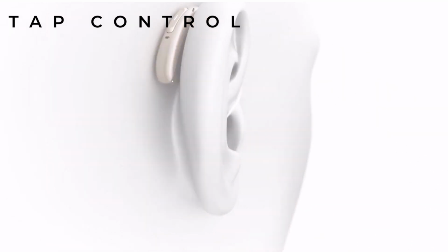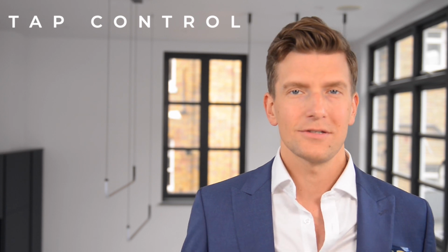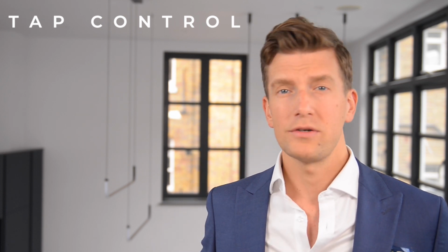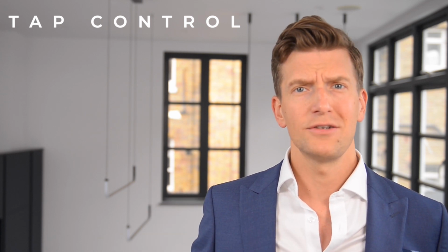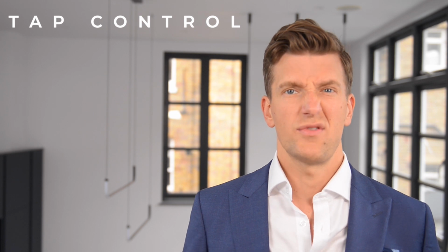This is great because it means that you can access other features without having to take your phone outside of your pocket. The downside is I've had to turn it off with a few patients because they've accidentally pressed it whilst tapping their ear, and they've got Siri or Google Assist talking to them just during a normal conversation, which has just driven them a little bit crazy.